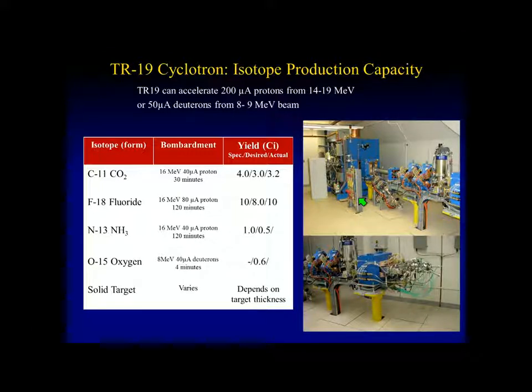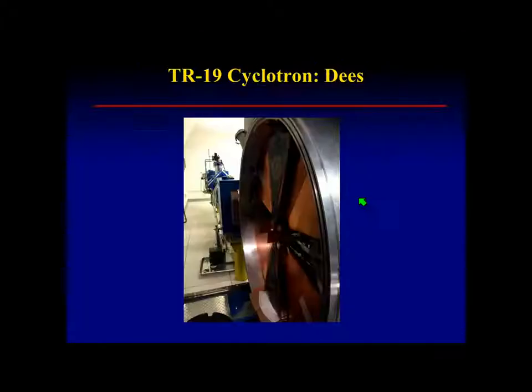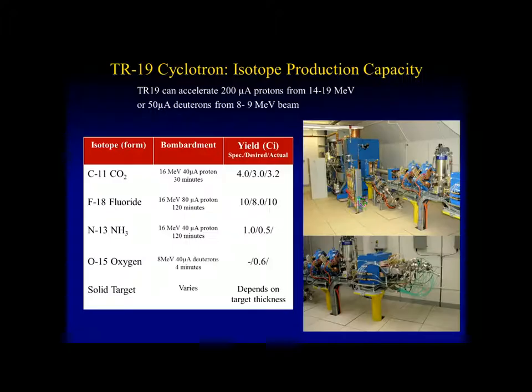And the newer generation cyclotrons are negative ion machines, so we ionize hydrogen gas typically, or deuterium gas, depending on what we want to produce, and then we accelerate the negative ion. And that does not interact with the machine as much, and so again, it's a much safer machine. You can turn it off, and essentially, very shortly afterwards, you can walk right up next to the machine. There certainly will be a dose rate from the machine, but it's not like your positive ion machine that you can't be near.